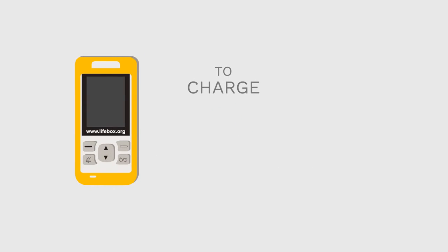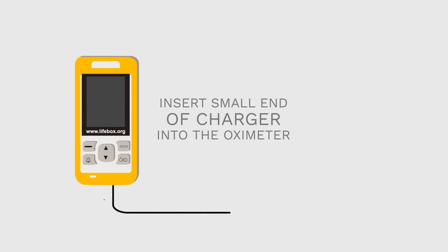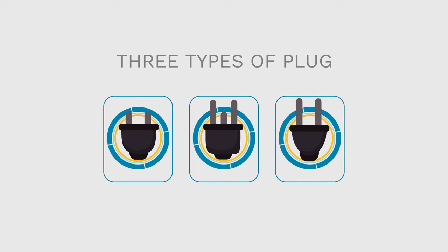To charge the oximeter and battery, insert the small end of the AC/DC charger into the bottom of the oximeter and the pins into an electricity source. The Lifebox charger comes with 3 types of plug. Depending on which region you're in, you may need to remove the pins from the base of the charger and replace them with another set.